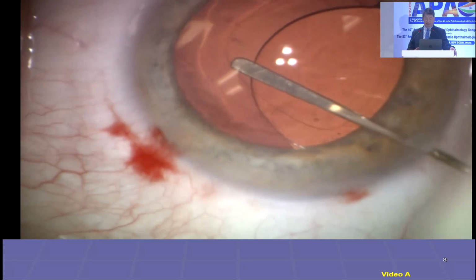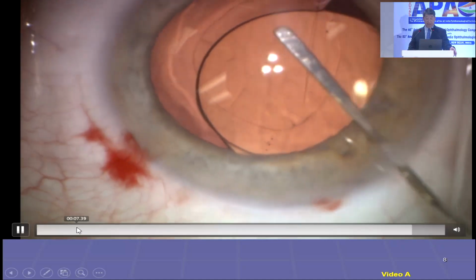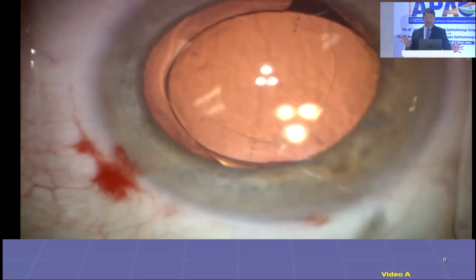And maybe I can rotate it. Okay, so this isn't looking so easy now. All right, so it's freed up. It's now worse because instead of 180, it's at 175 or 170. What would you do next, audience? Hooks? Who would put in a CTR? All right, okay, so I think that's going to solve it.